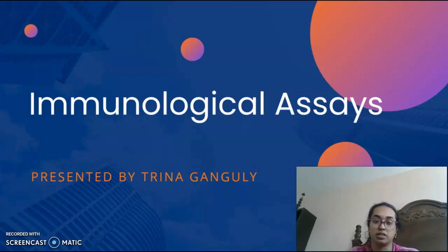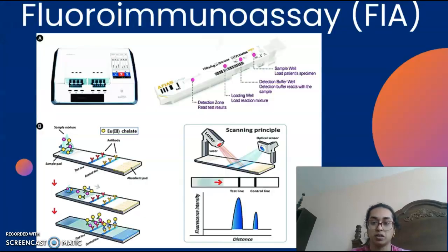Today I will be discussing three different types of immunological assays. First, I'll begin with fluoroimmunoassays. In this image, we can see the procedure for this type of immunological assay.